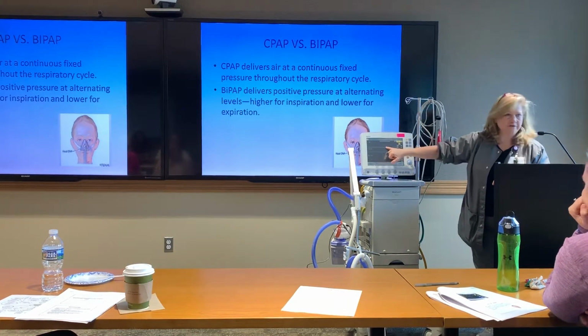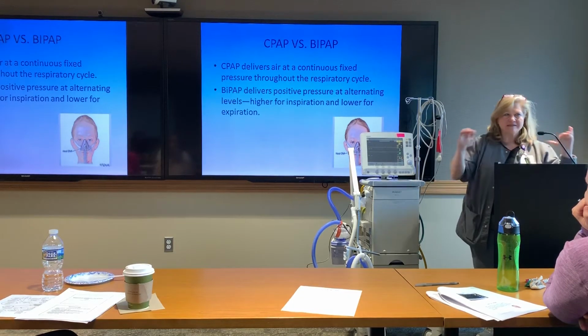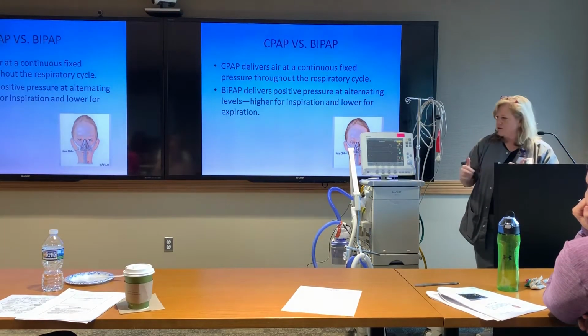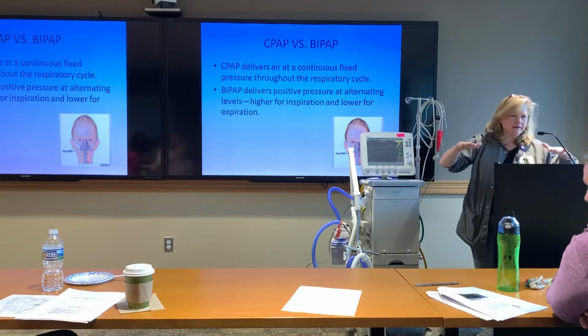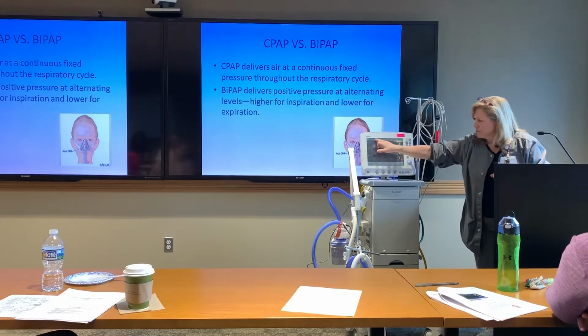But I have a little bit of pressure here. You see that yellow line going across the top? That's the amount of PEEP, CPAP, EPAP, whatever you want to call it. It's baseline pressure that we're keeping in the lungs so that the lungs don't completely collapse at the end of the breath. All right?